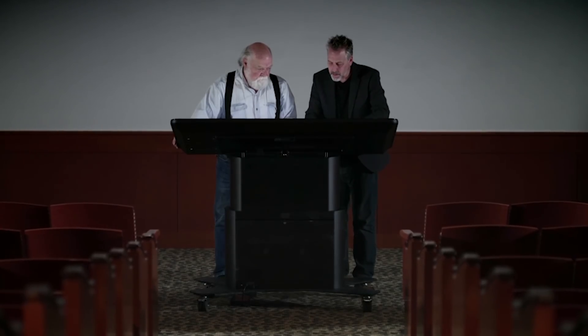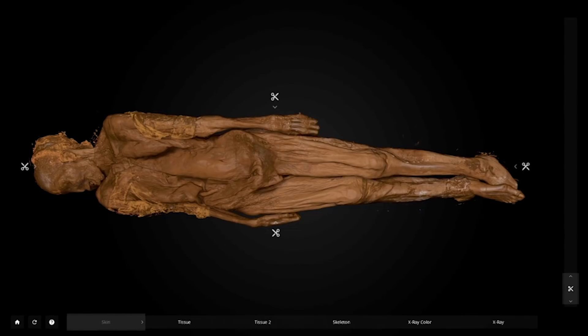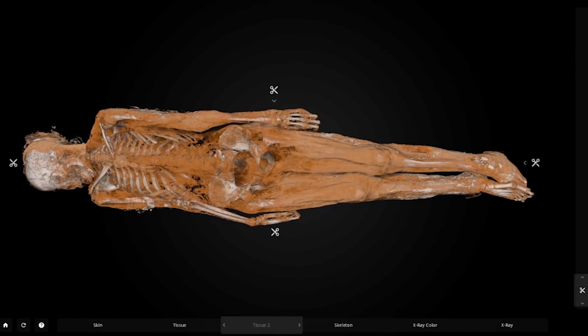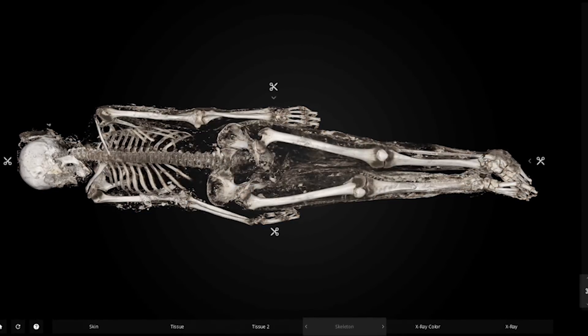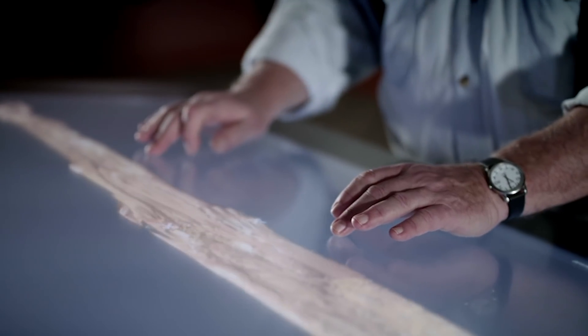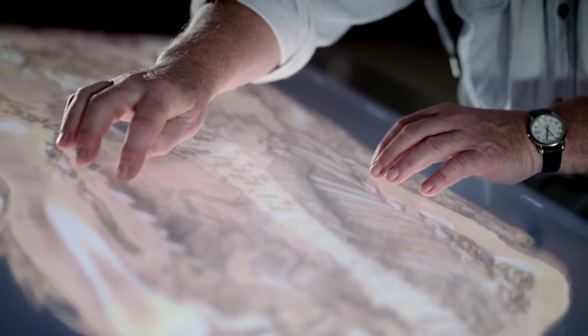The original CT scans Jerry made of the woman have been loaded into a piece of groundbreaking software. It allows for a virtual autopsy of the body, unlocking the secrets contained within without making a single incision. Normally, I'm looking at sections or regions of the body, but this lets me see the entire body and I can spin it and roll it and go into it and come out of it. This is a way that I have never been able to look at a body before.